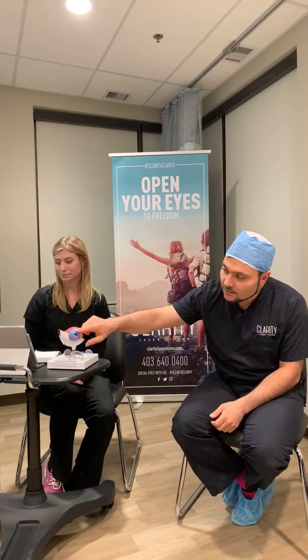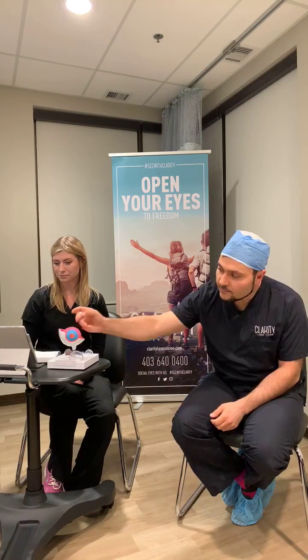If you look at this model, the cornea is a round structure, and this structure, which is about 0.5 millimeter thick, is ultimately responsible for most of our clarity when we see things. So in someone who's, for example, nearsighted, what we would be doing is we're trying to flatten the cornea from being perfectly round like this to being slightly flatter, and in doing so we achieve improvement to the vision.